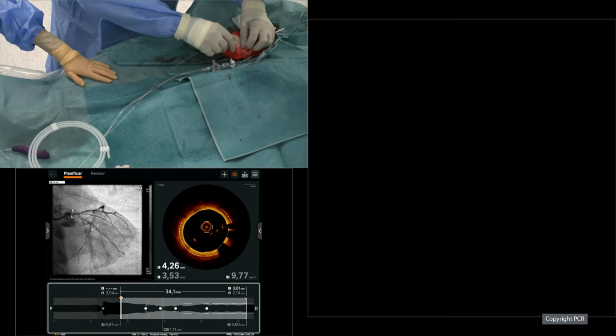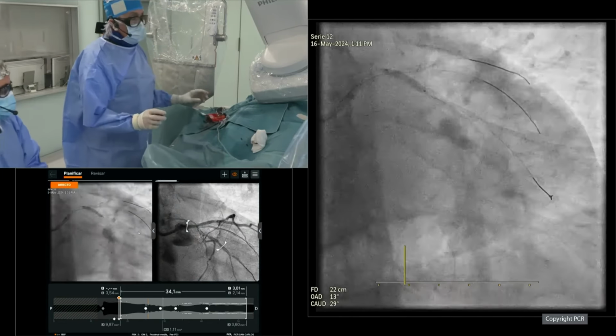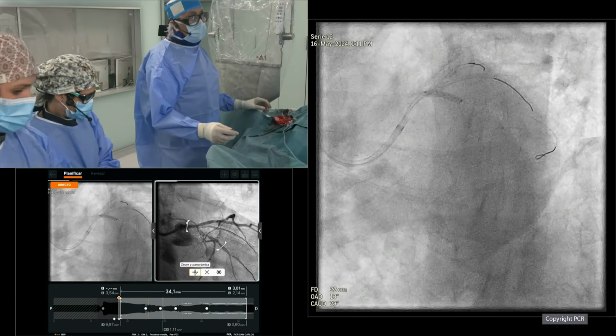And also the stent. So you know, remember, it's a highly eccentric lesion. It's a nodule, and you can see that the plaque preparation has been very good. The compliance of the lesion has been improved, and now what you have is that the balloon is opening nicely and evenly. Okay. Now, my suggestion is 1 injection to see that after this dilation of the trifurcation. Un momento, un segundito, no lo abras todavía.